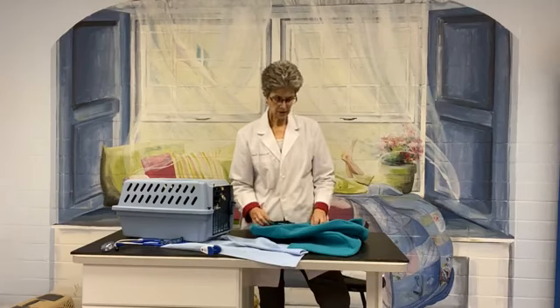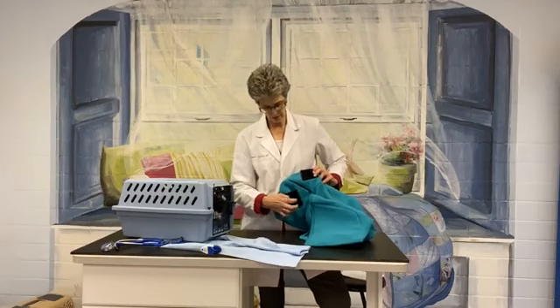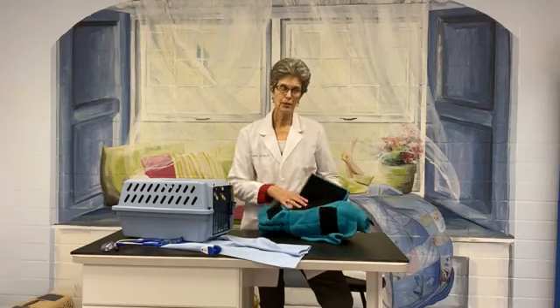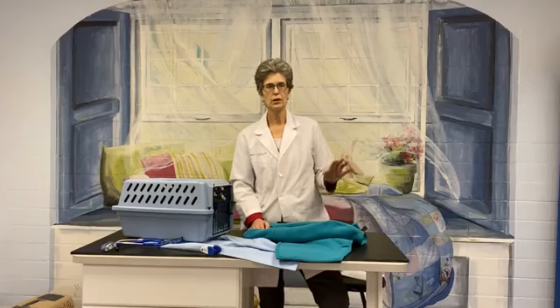For clipping nails, you can position the leg out through these different spots here, and also up here for the front legs for nail clipping, and that can be a lot easier for the cat and easier for you in reducing bite risk.